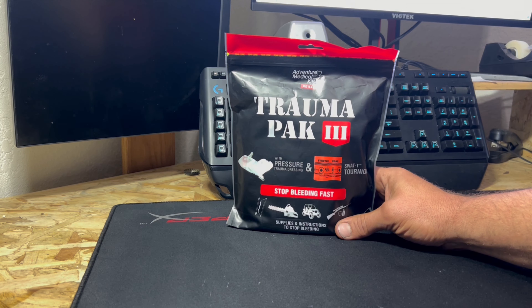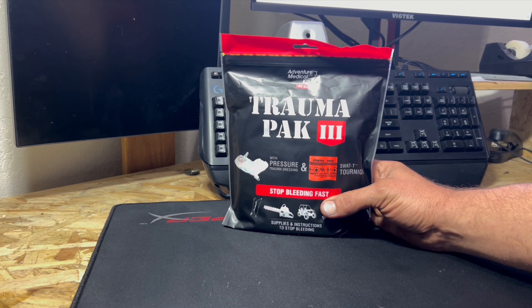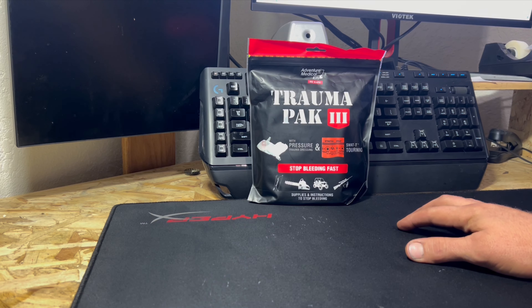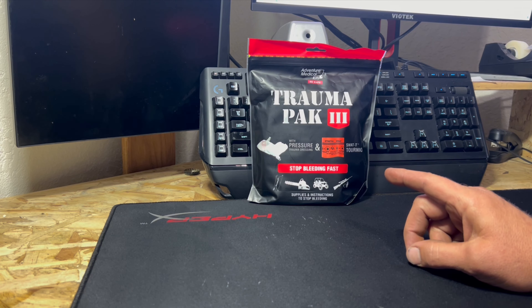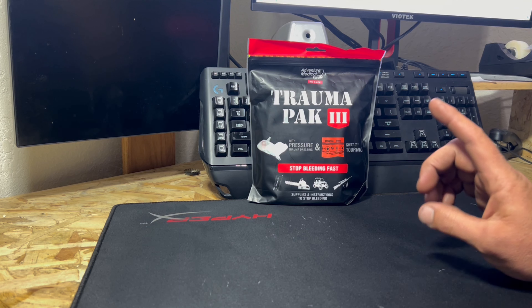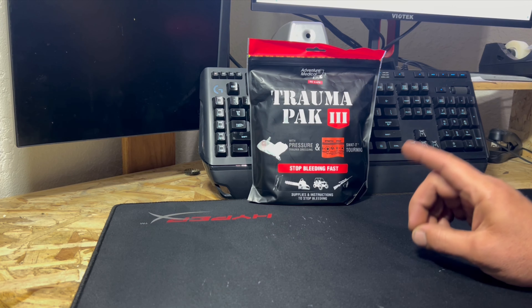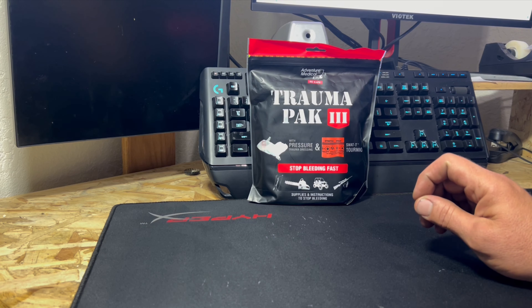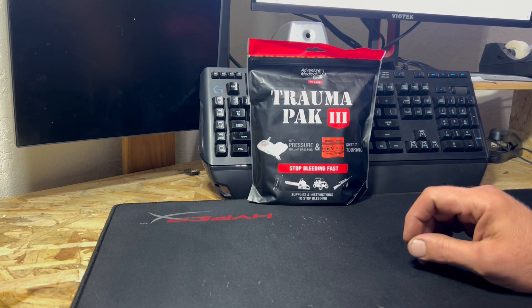So what I want to do here is give you a full breakdown of this Adventure Medical Kits Trauma Pack 3. This is a bleed control kit to help reduce heavy blood flow. I'm going to show you a cost analysis — we're going to take the actual cost of this pre-packaged kit and reassemble it through Amazon pricing to see if we can get a better value. Then we're going to rebuild this trauma pack using that same cost, either purchasing it outright or assembling one that's better value and better application. Let's get into this.